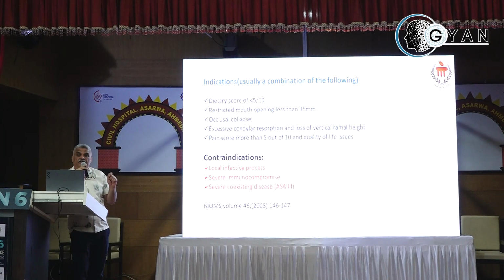I've seen more failures in TJRs in my career. When I started off in possibly 2013, I've seen fractures of joints, I've seen infections, allergic dermatitis, patients coming back with severe pain, a first bite syndrome. All these, it's only time which is going to tell us.